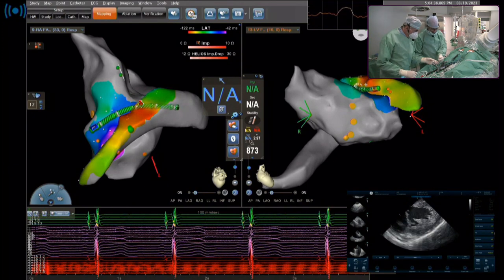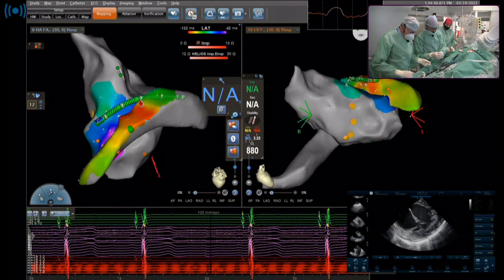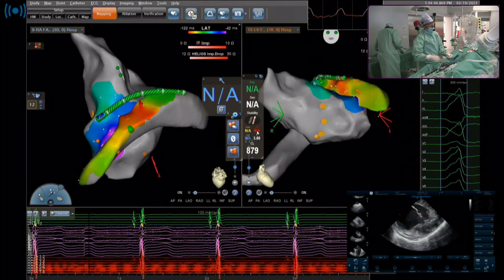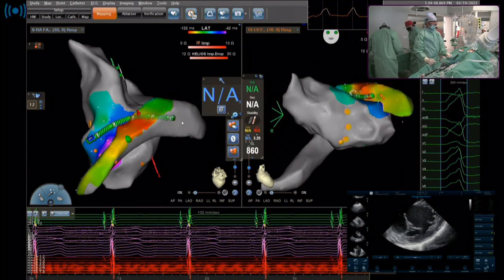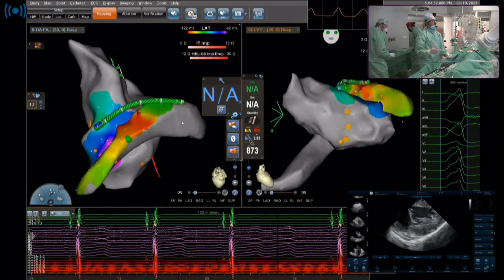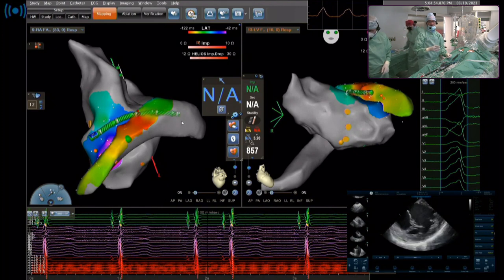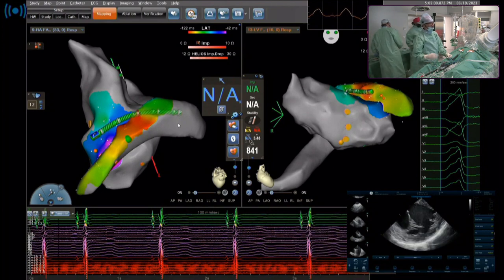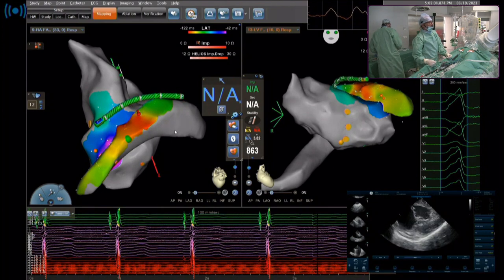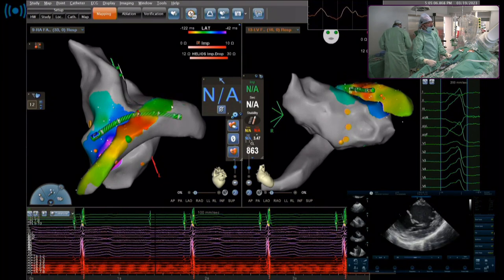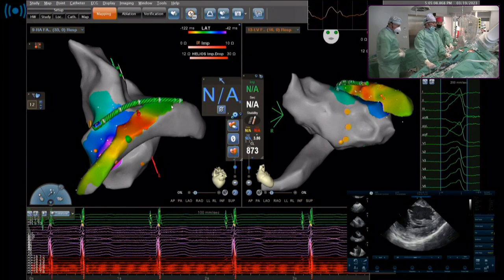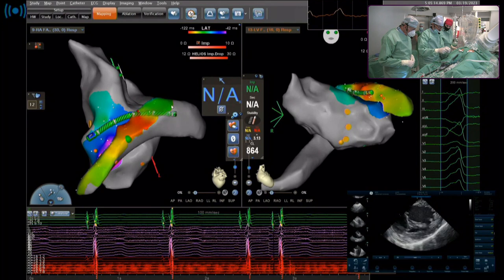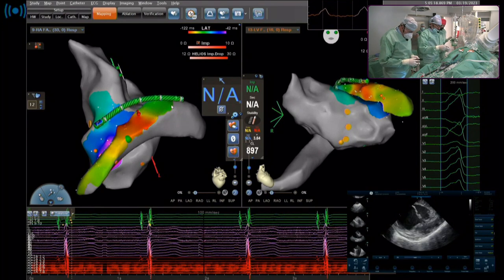We're going to go with an angioplasty wire - a vision wire. The idea is to get depth into that vein and map with the wire deeper intramurally. The nice thing is that the vein is small so we don't think we'll need a double balloon. If we get good signals from the vision wire, we probably can deliver a good lesion with a single balloon of alcohol.